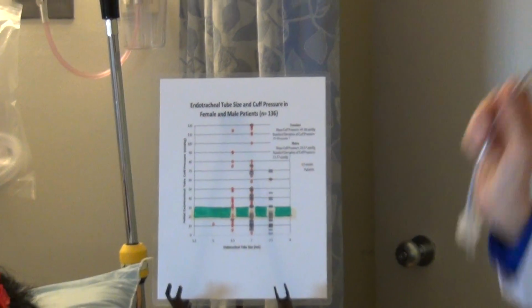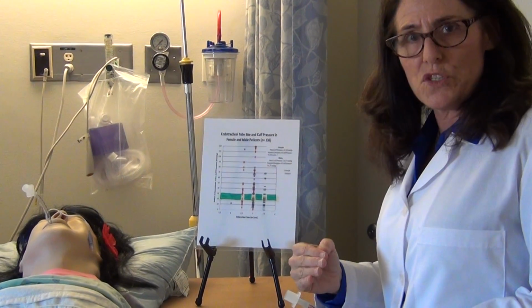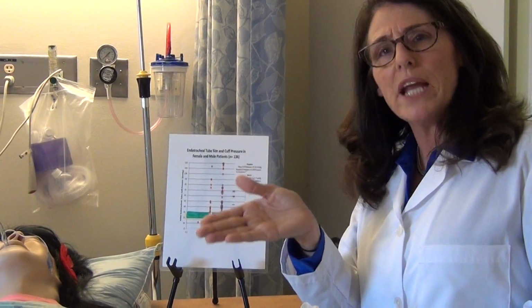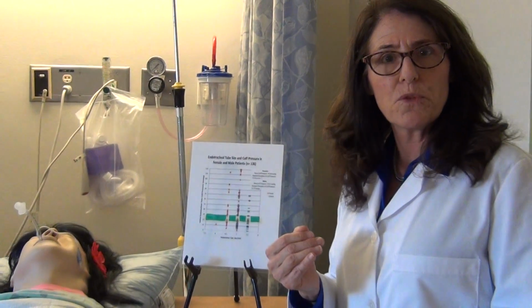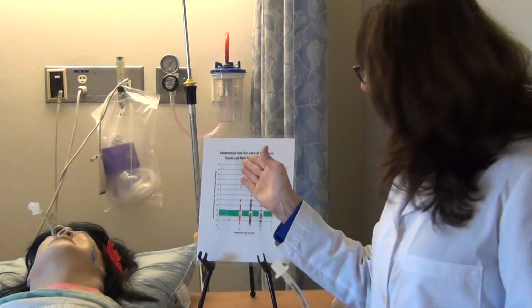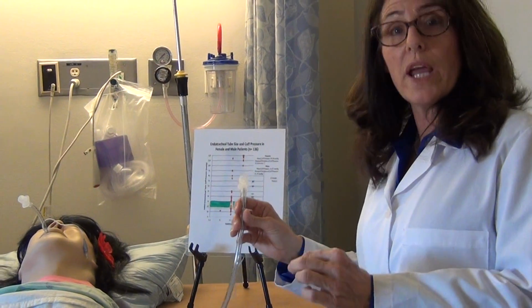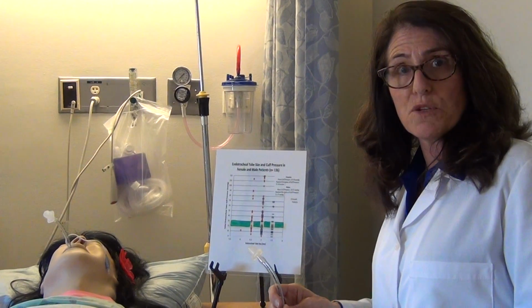Another thing about this study, and it is a flaw of it, is that the top bar shows 120, but as a matter of fact, a standard manometer only goes to 120. So if it's buried beyond 120, is that a pressure of 200? Is that a pressure of 300? It could be 400. No one knows because it's buried beyond 120. One more reason, we have to check the pressure with the cuff manometer each and every intubation.